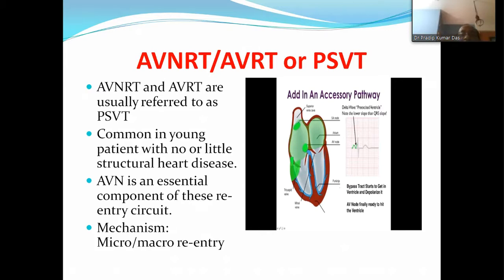Because of this effect, the PR interval is shortened, because earlier conduction causes a shortened PR interval, and the ventricle has already started to depolarize. Here is the small upstroke, which is delta shaped, and the QRS complex is widened. So three effects occur in the ECG due to this accessory pathway. We will see it later clearly.